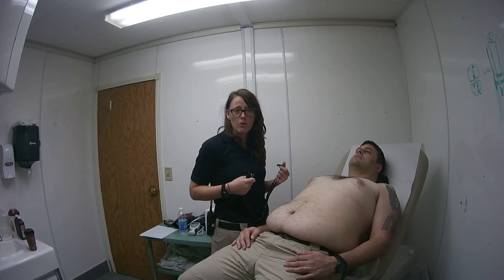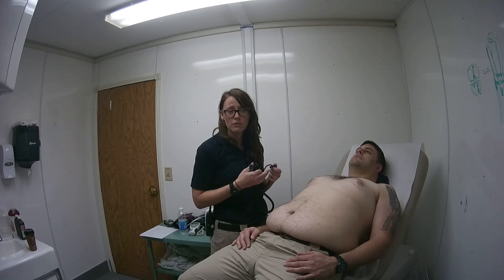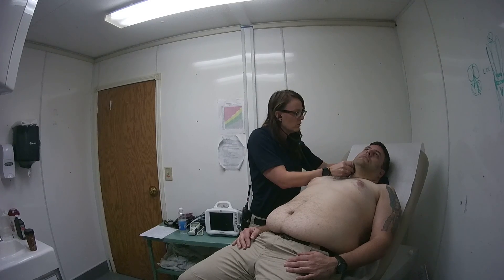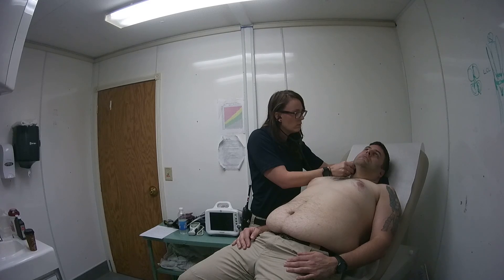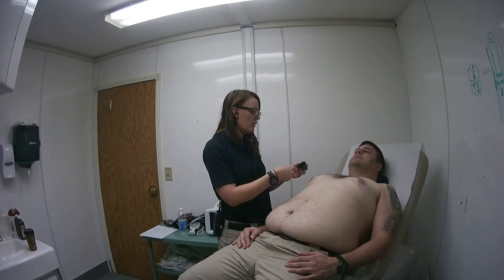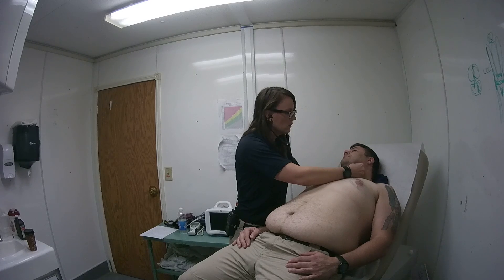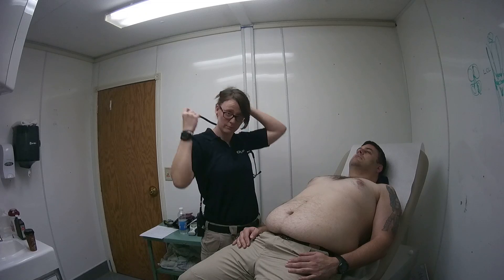It's recommended to use the bell of a stethoscope. I actually only have an adult diaphragm and a pediatric diaphragm, so we'll just use the diaphragm for the remainder of the assessment. If I could have you turn your head slightly to the left and hold your breath for roughly five to ten seconds while I listen. We're going to do the same thing on the left side — turn your head slightly and hold your breath. No bruits observed or auscultated.